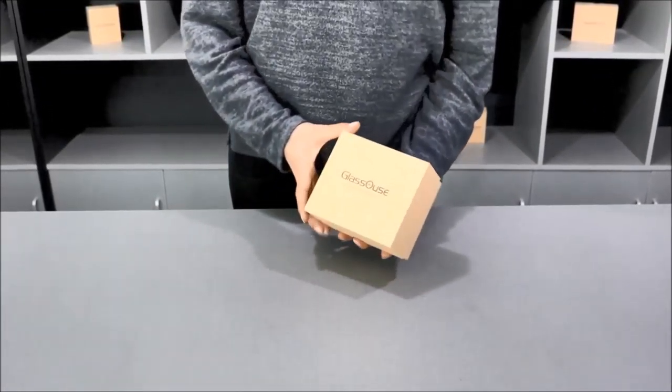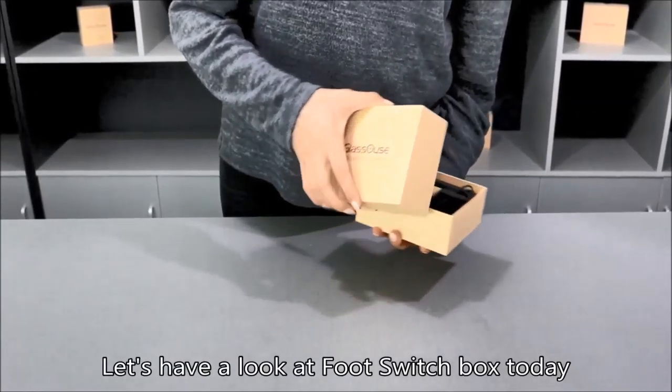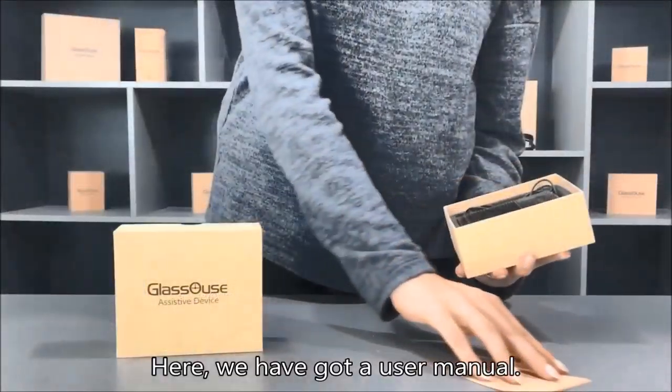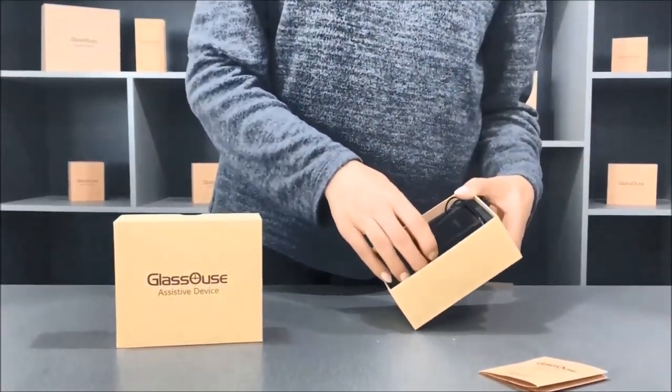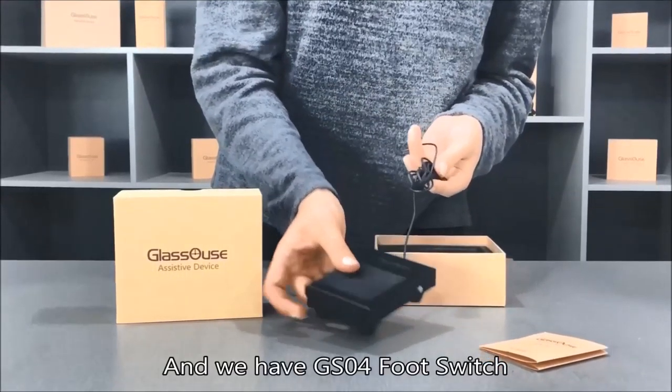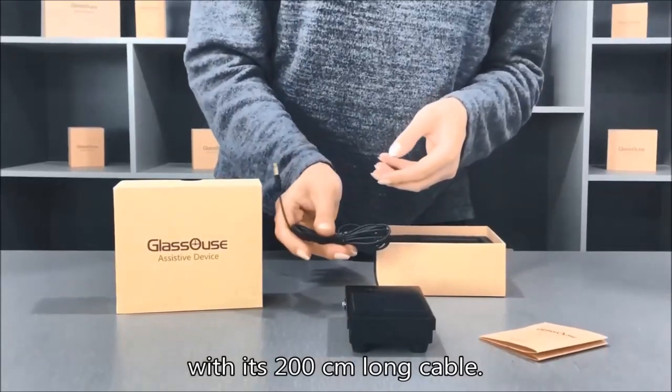Hello everyone, let's have a look at a foot switch box today and what is inside. Here we have a user manual and the GS04 foot switch with a 200 centimeter long cable.